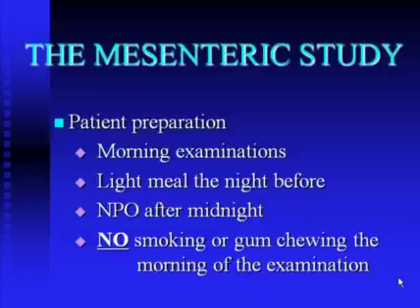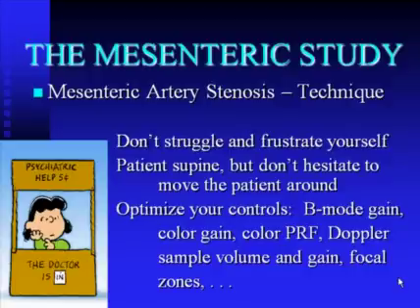And on their way in for the examination in the morning, they should definitely not engage in any smoking, gum chewing, candy eating, anything of that nature, as all of these will contribute to significant bowel gas, rendering the study much more difficult to perform. So this is all the patient preparation we really need to do. We do tell patients the day before, when we call them, if they do need to take medications for any other medical problems, it is perfectly all right to take those medications using small sips of water at their normal time. But again, a light dinner, NPO after midnight, and refrain from anything on the way in for their appointment.